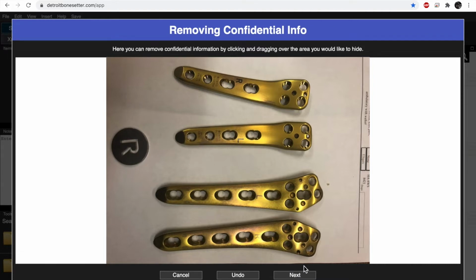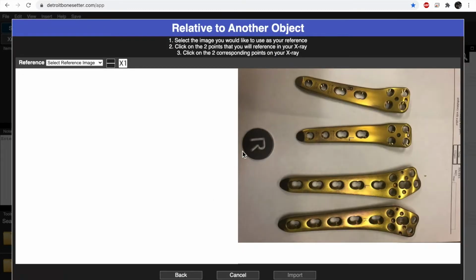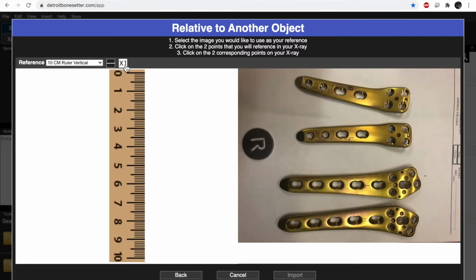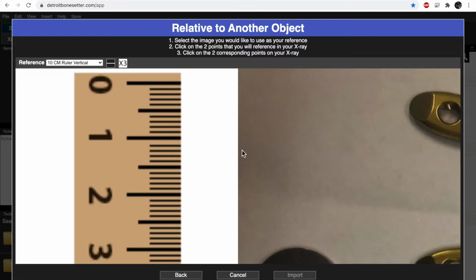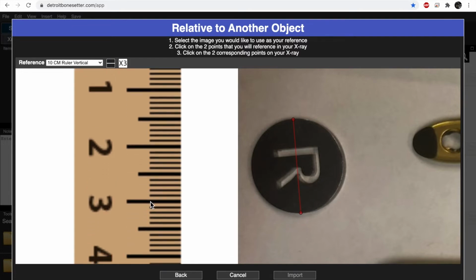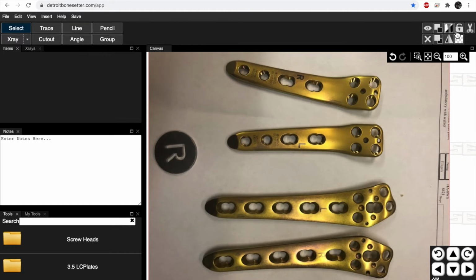And so what I'm going to do here is go next, and do relative to another object because it's not an x-ray. I'm going to select the ruler, and I'm going to magnify this so I'm a little bit more accurate, and I'm going to take the longest diameter of this, which I believe is about here, and that is a 3 centimeter sizer. I'm going to make it equal to 3 centimeters on Bonesetter, and I'm going to import it. And now this is sized. So then I'm going to lock it.